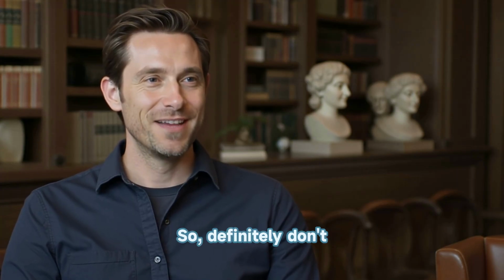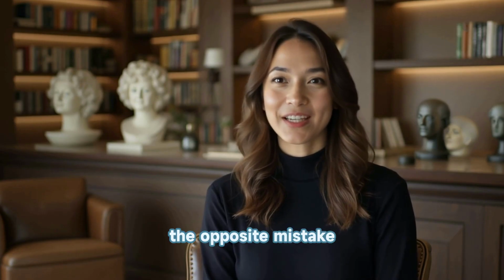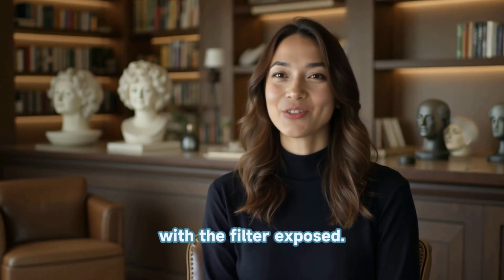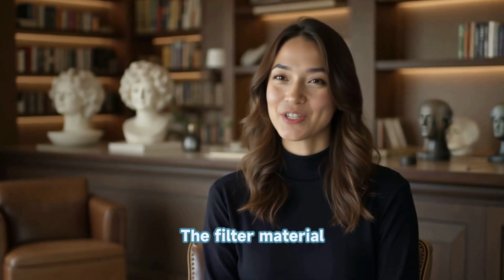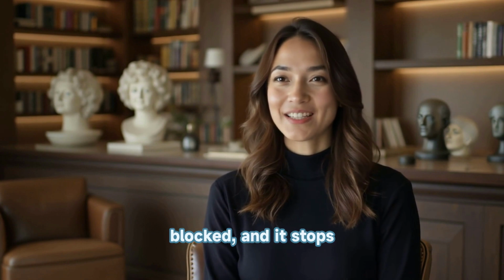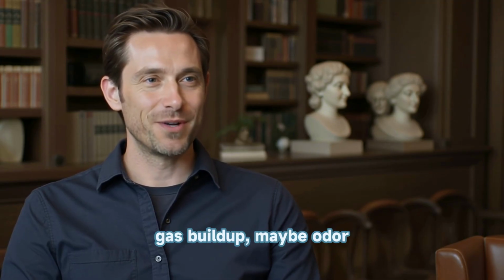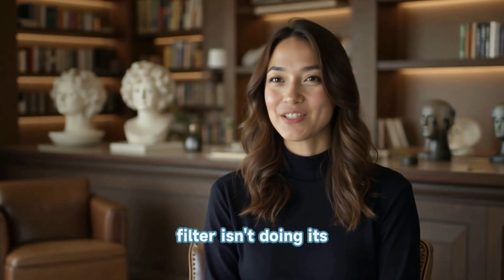Okay, so definitely don't leave it covered all the time. What's the other way things can go wrong? Well, the opposite mistake is never using the sticker at all, just showering or swimming with the filter exposed. And as you said, the water can clog it then. Right. The filter material gets wet, potentially blocked, and it stops functioning correctly. So even though you haven't intentionally covered it, it's effectively blocked anyway. Leading to the same problems, gas buildup, maybe odor issues if it can't filter properly. Either way, incorrect sticker use means the filter isn't doing its job.